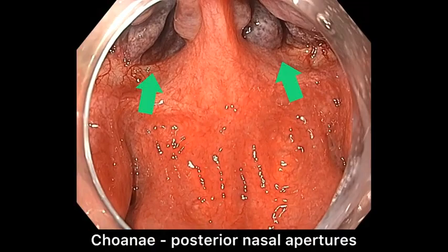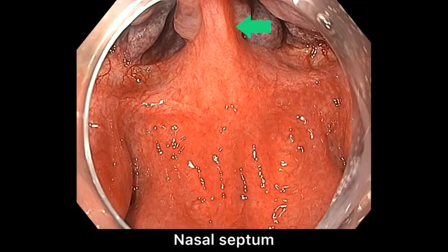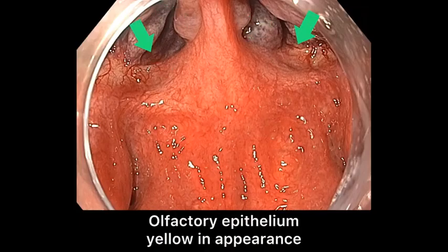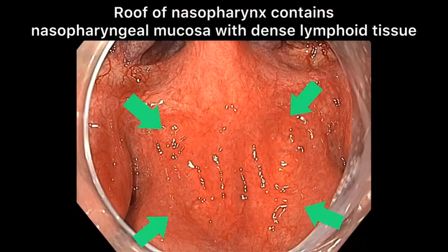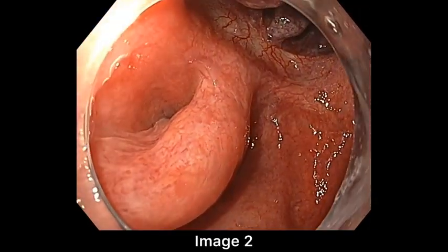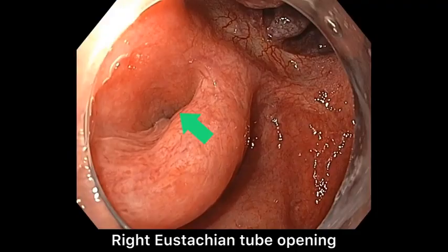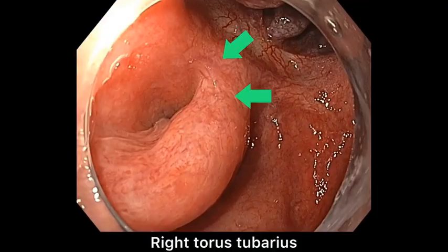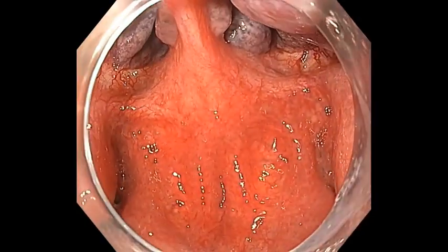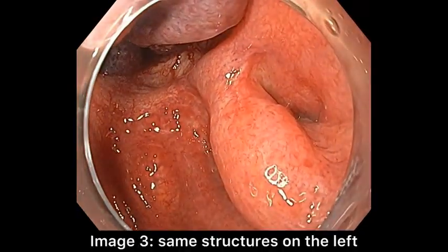Image 1, centered view. Choanae, nasal septum, posterior ends of turbinates, and the olfactory epithelium. The roof of the nasopharynx contains nasopharyngeal mucosa with dense lymphoid tissue. Image 2 contains the right eustachian tube opening, right torus tubarius, and the right fossa of Rosenmuller. Image 3 is of the same structures on the left side.